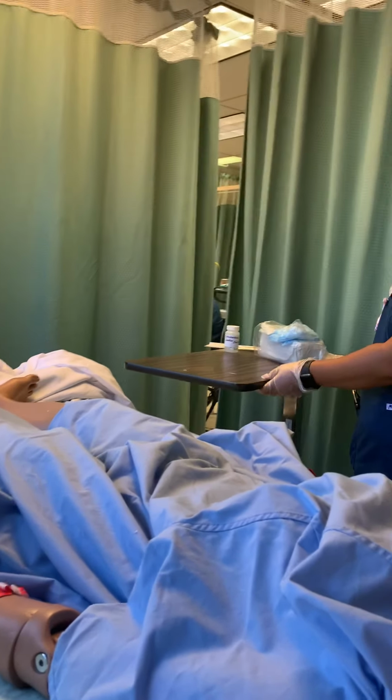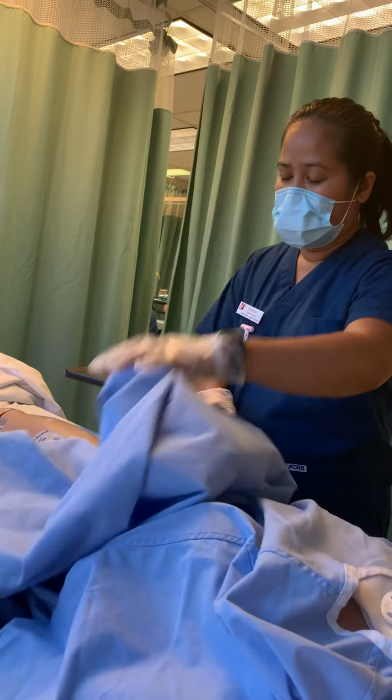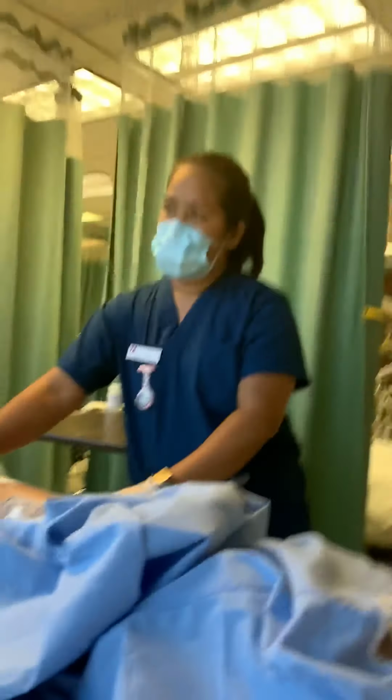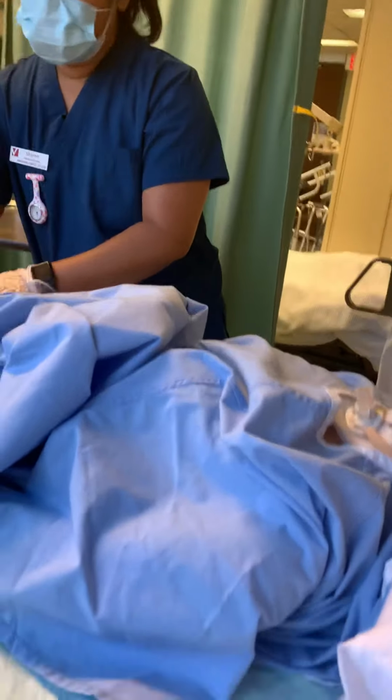So I'm getting my things ready. Mr. David, I need to wash you, give you pericare first. For male, it's only abduction. But pretend this is female. For female, you have to do dorsal recumbent first, and while you open it, make sure to check skin integrity again. It's very important. Sometimes if they're obese, there's lots of redness and itchiness there. Give a good pericare to avoid contamination.